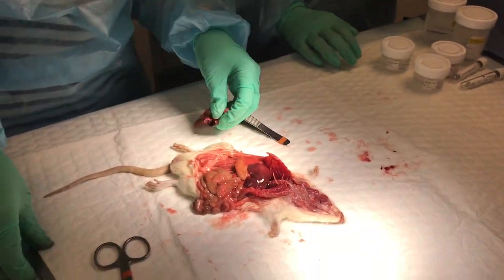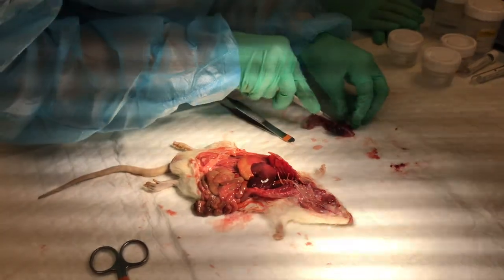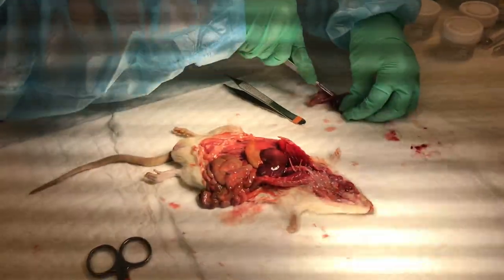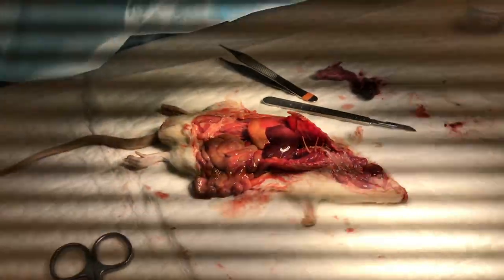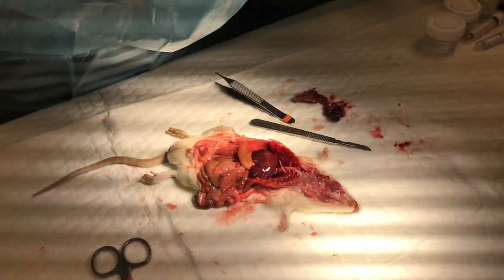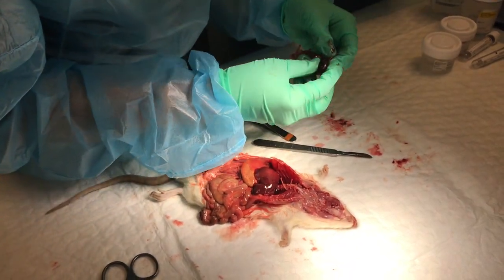So we can take a sample of lung. And then I don't know if you can do it in a rat because they're really small, but you're supposed to cut open the heart and actually visualize all 4 chambers. But it might be a little hard.